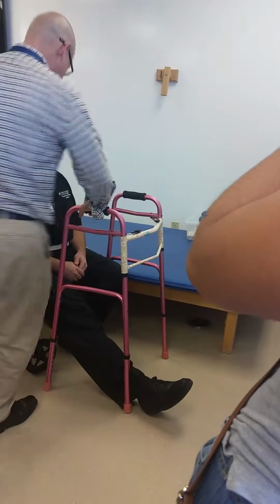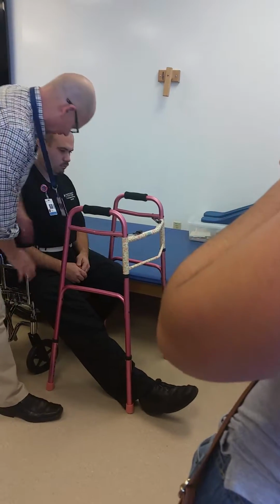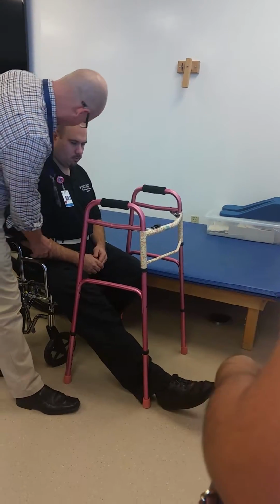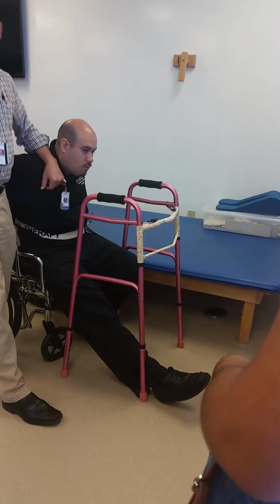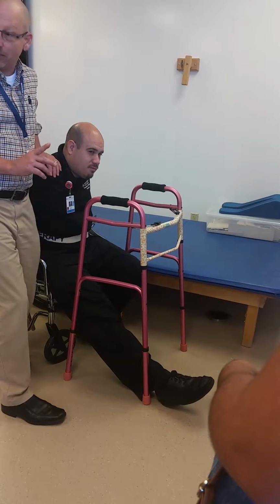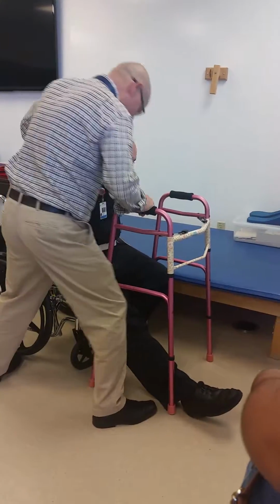All right, so let me show you this way first. Okay, Randy, we're going to stand up. You're going to push up really hard with this leg. You're going to take both your hands and push from back here on the wheelchair. Okay, in just a second now. I'm holding him down because I can see Randy wants to stand, but I'm not ready for him to stand, so I'm giving him some tactile cues. Don't stand.